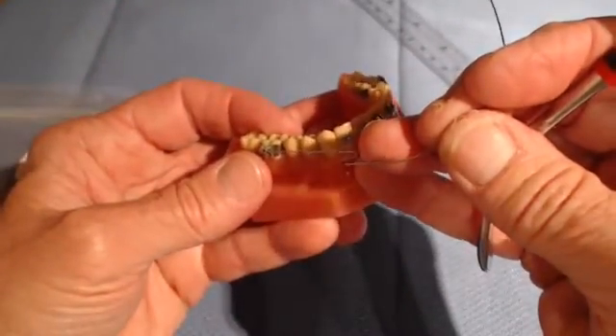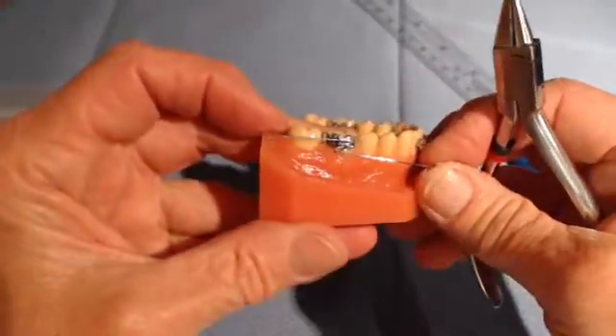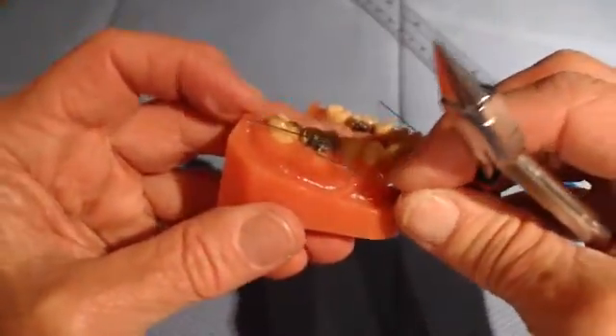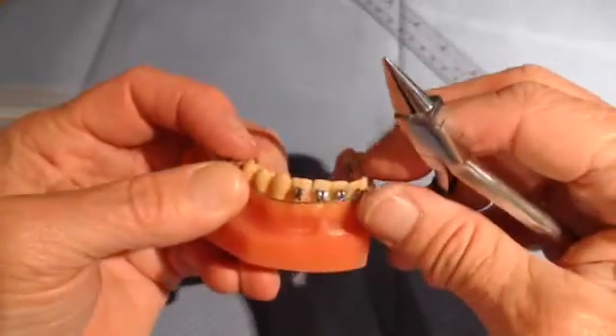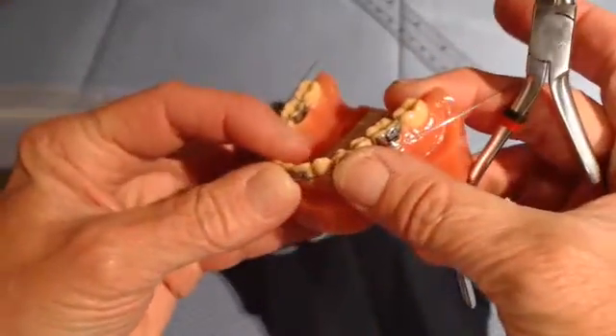Now we will insert that into the molar tube. It's going to go under the molar hook — you can see that right there. And this acts as the stop, if you will, to affect the advancement that we're going to do at the end of this presentation.